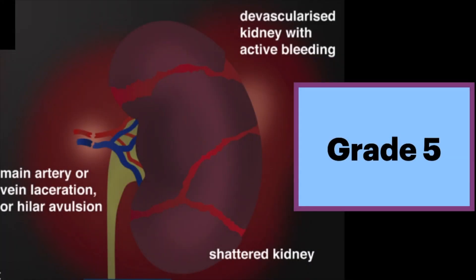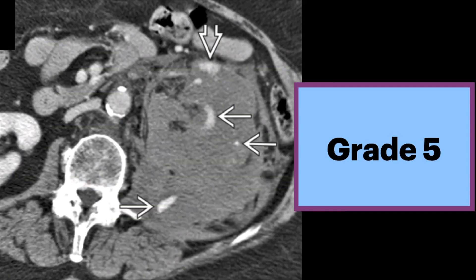Last is a grade 5 injury. The kidney is shattered and devascularized with active bleeding. The main artery or vein are lacerated with hilar avulsion. This CT shows multiple sites of active arterial extravasation and a fragment of the fractured kidney. Emergency nephrectomy was performed due to the extensive parenchymal damage and active bleeding.